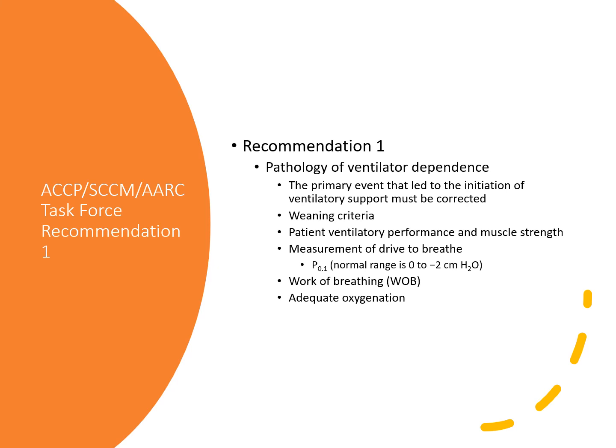Traditionally, you monitor the patient for that 30 to 120 minute wean, depending on the patient's toleration, and then we can see how they're breathing during that, their mental response, and we can make our decisions on that. For a lot of years, we'll try to look at things like muscle function, like a vital capacity, and some vents have a spontaneous mode or respiratory parameters mode where you can make the patient do a vital capacity maneuver. We'll look at their minute ventilation, their rate, their spontaneous tidal volume, and their rapid shallow breathing index.